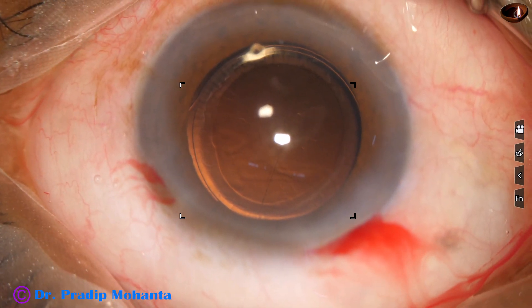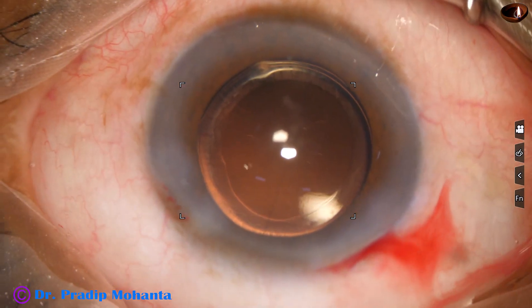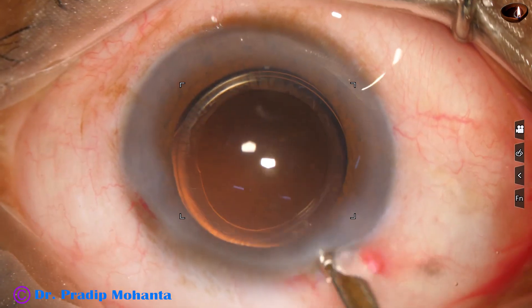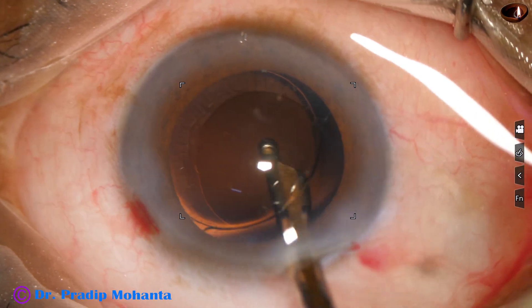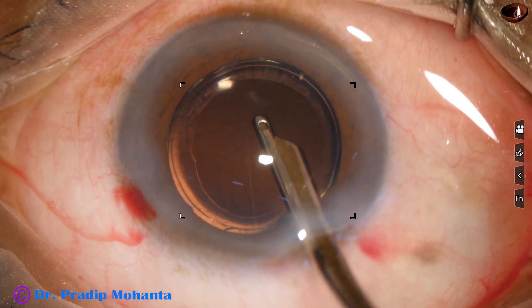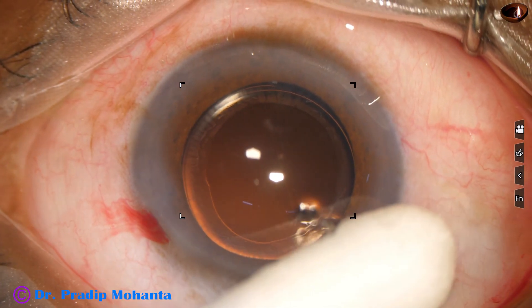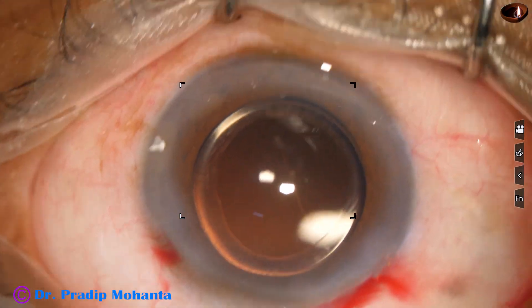This is a drop of moxifloxacin. The side port is closed by hydrating the corneal stroma. The anterior chamber is nicely lavaged with BSS — balanced salt solution — and the capsular bag is irrigated once more, the posterior capsule is polished to some extent, and the anterior chamber is formed very nicely. The intraocular pressure should be on the higher side. Check the wounds with a cotton-tipped applicator — no leakage from any wounds. A few drops of moxifloxacin are applied over the ocular surface and the case is concluded.